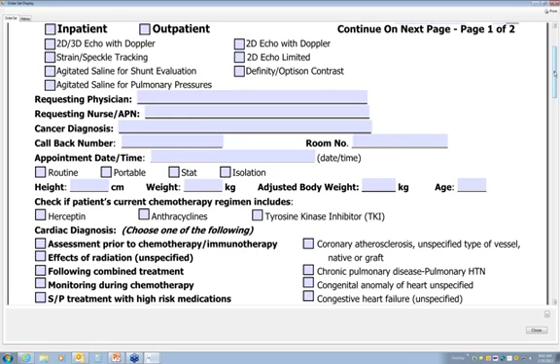And I can tell you that, to be completely honest, not all of them are interpretable. Like I said, the biggest killer is the image quality, and the second is conduction abnormalities. I've noticed that even with an incomplete right bundle, even with an incomplete left bundle, we get these defects in the anterior wall, and you have to take it with a grain of salt. You have to know the limitations, and you cannot be very prophetic about it.